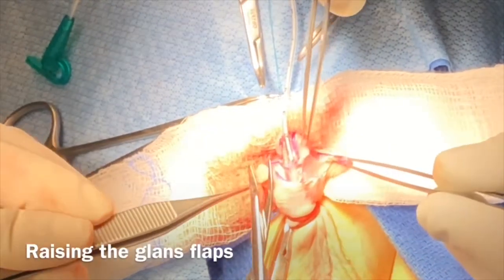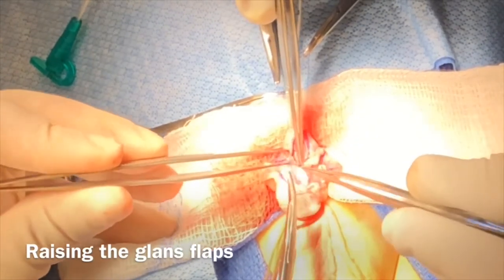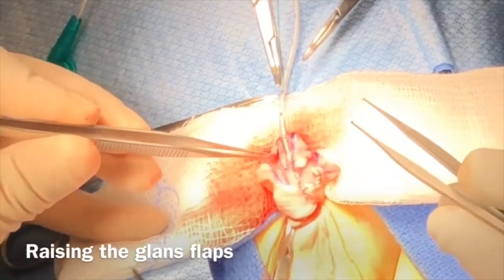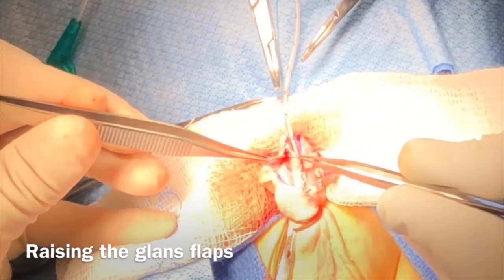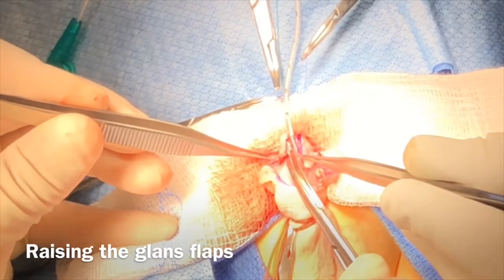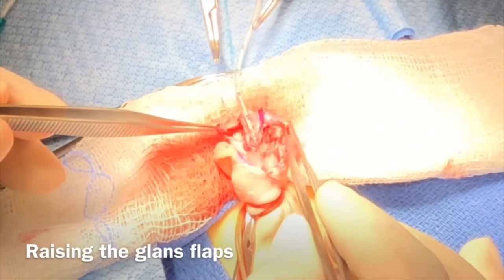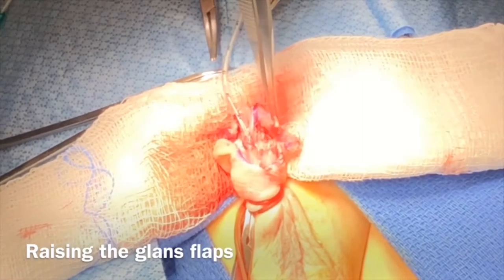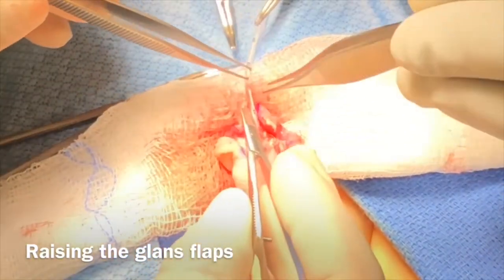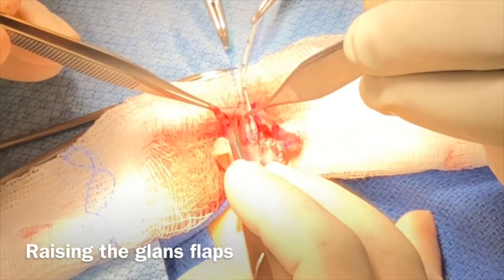Followed by this, the glans flaps are elevated using a serrated scissor, which allows separation and incision precisely and at a proper depth. It is very important to mobilize the glans flaps adequately so that the urethroplasty can be performed and the glans flaps come over the urethra satisfactorily.